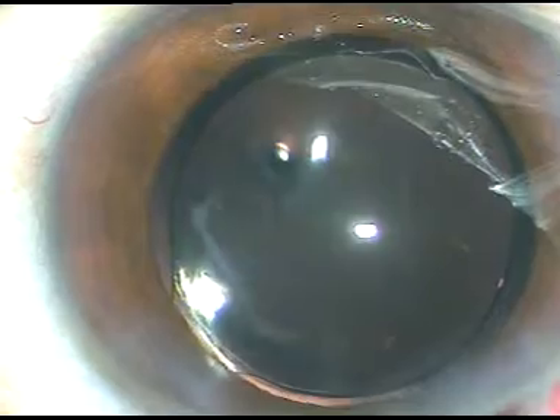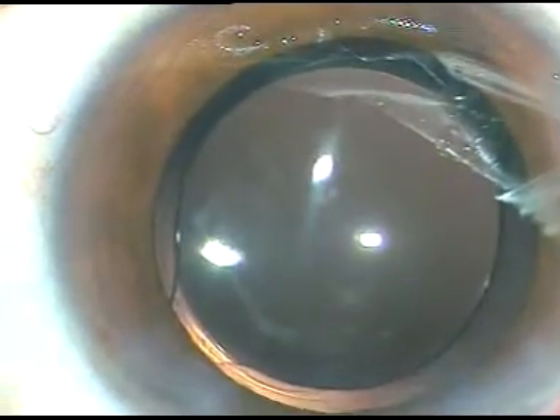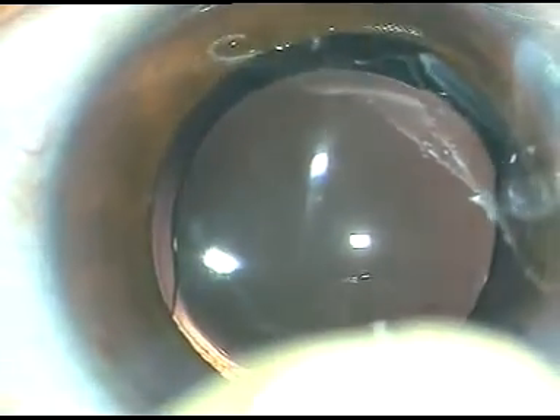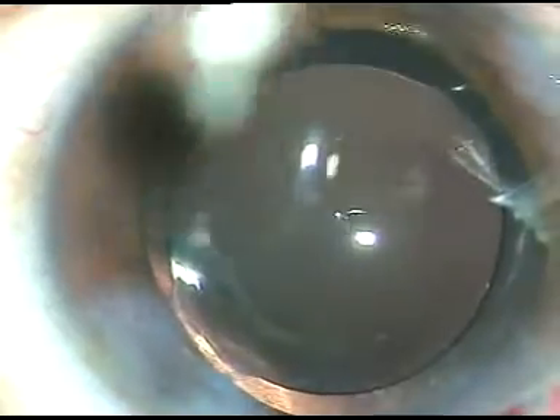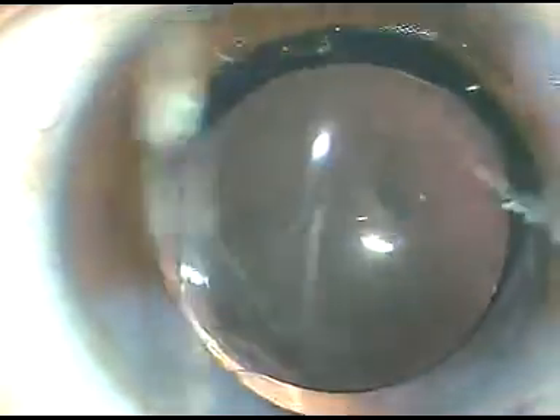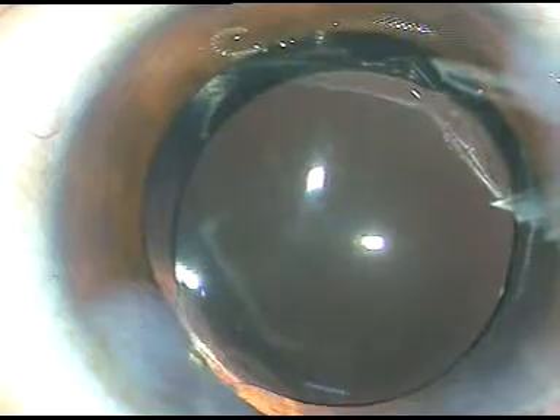Now I use a bit of moxifloxacin — here it goes — and then I use BSS to hydrate the side ports. In most cases, my main incision doesn't require any hydration. I hydrate the side ports and give a final wash — this is the fourth wash — to remove the viscoelastic substance. This is a view under higher magnification. At this time, the viscoelastic substance that sticks to the endothelium comes out. I use the Simcoe to remove the visco from the endothelium. So in four stages I have removed the viscoelastic substance.